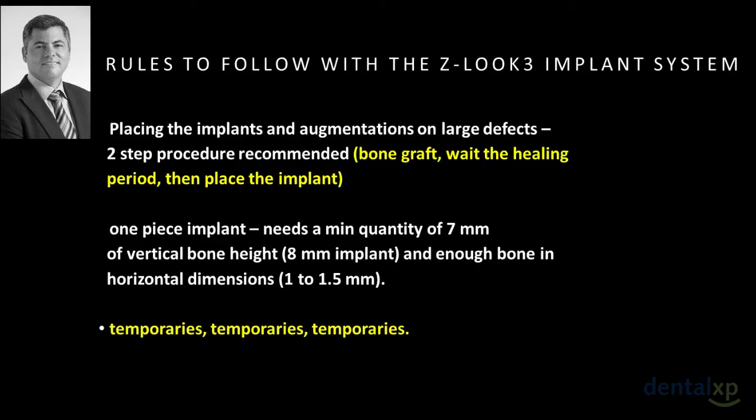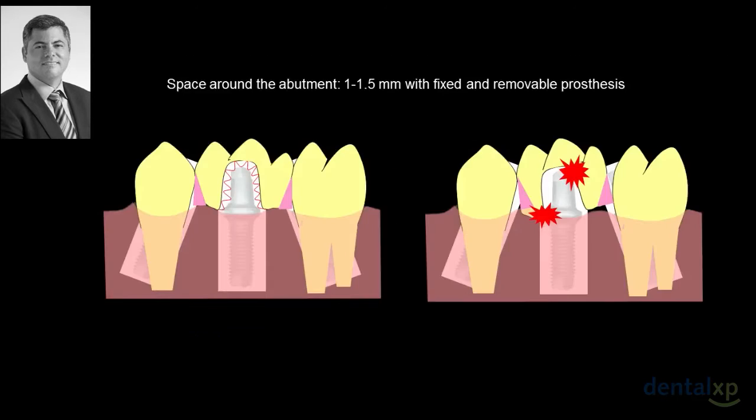It is just a personal choice based on the population of my practice, which are patients with parafunctional habits and TMJ disorders. The management of the site posterior to implant placement becomes important for success. Most clinicians recommend that the implant should be kept away from forces. Therefore, it is important to create a prosthetic environment in which the implant is completely isolated from masticatory and lateral forces.